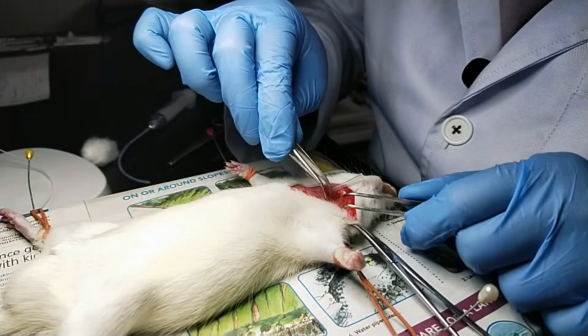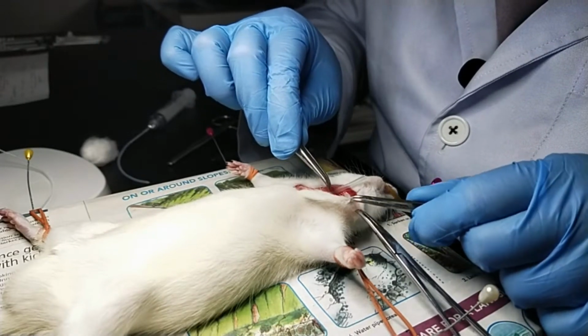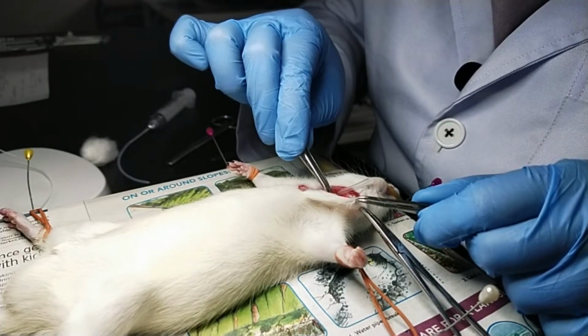I have located the jugular vein here, and we need to isolate the surrounding fat layer.